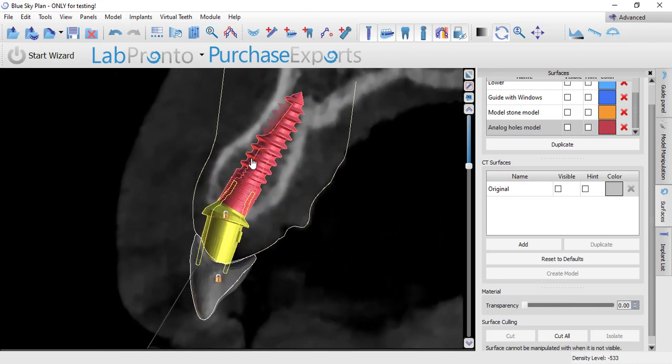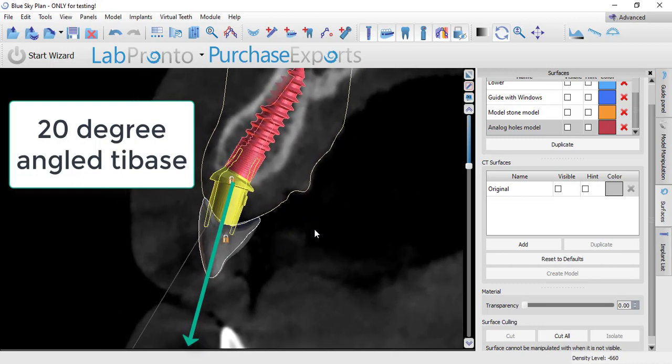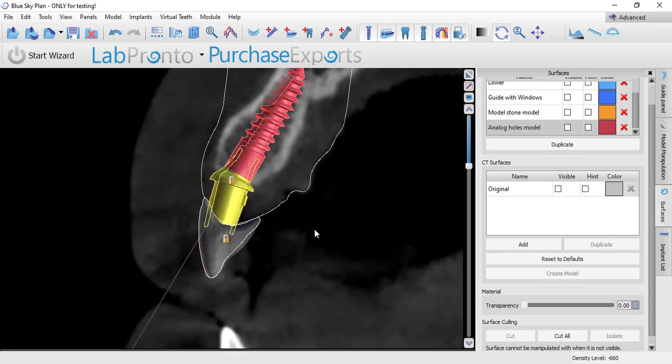One of the things that Blue Sky Bio offers is an angled tie base. You can see we have those angled tie bases in both an engaging and a non-engaging version. The easiest thing to do if you're doing this as an immediate load temporary would be to use a non-engaging — that way you can spin it around and put it wherever it needs to be. If you want to use a stock angled tie base at restoration time, that doesn't help you.